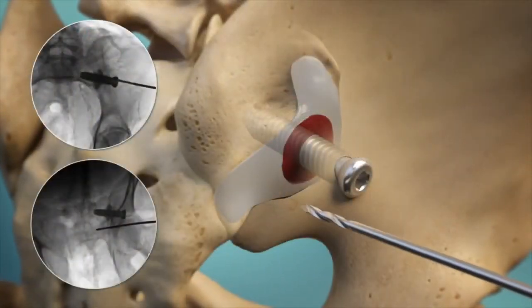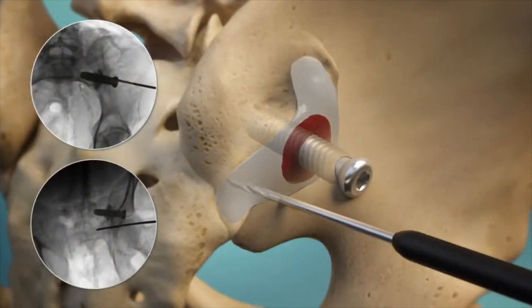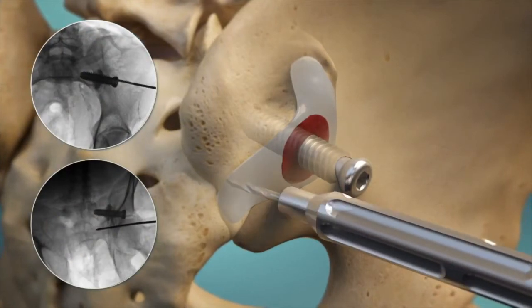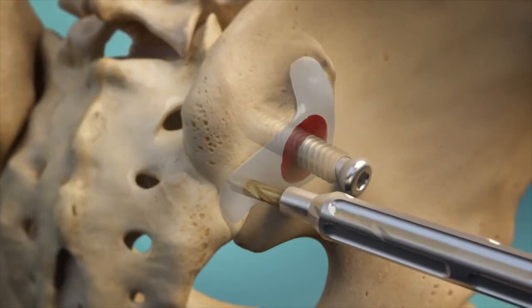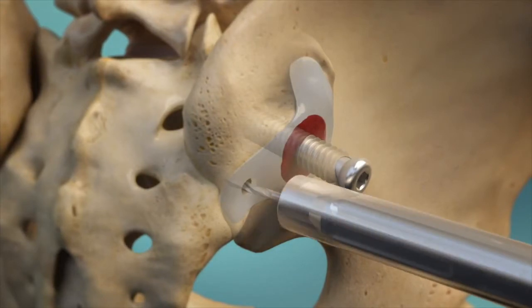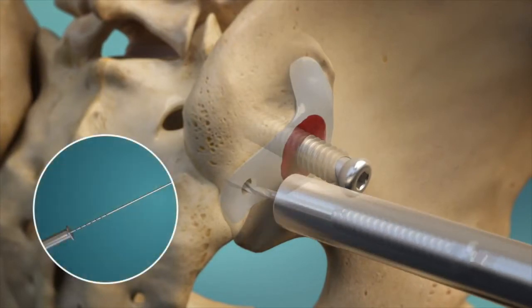A second implant provides additional stabilization by preventing joint rotation. A safe trajectory is once again established using the guide pin, and a new access channel is created through which the implant can be placed. After determining the length, the second implant is delivered and securely tightened to complete the fixation construct.